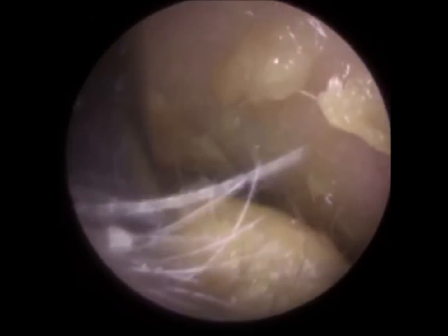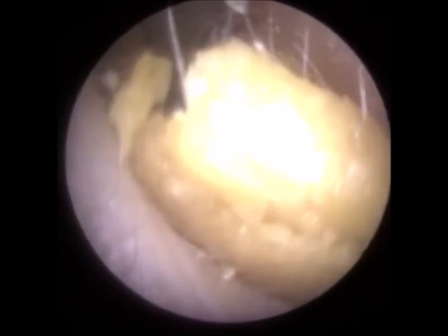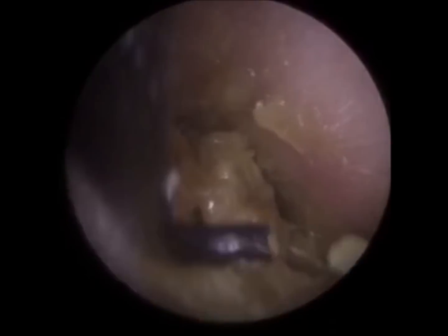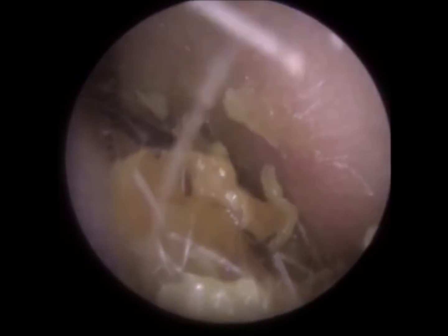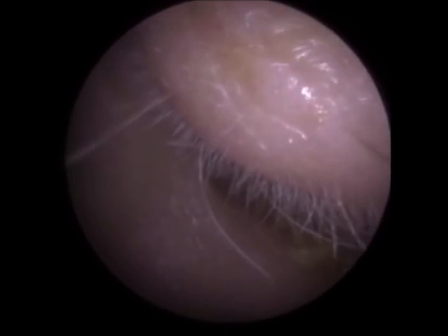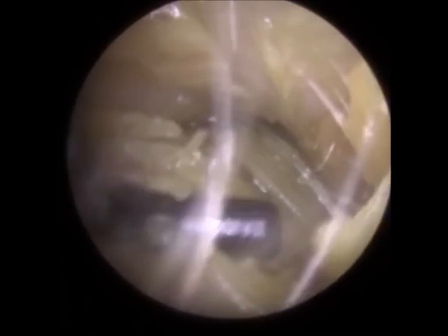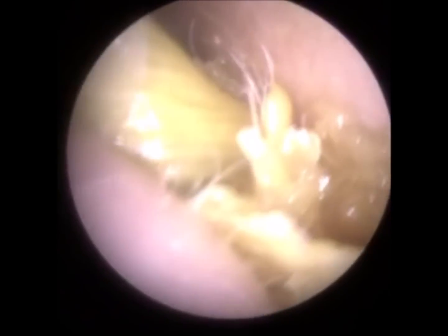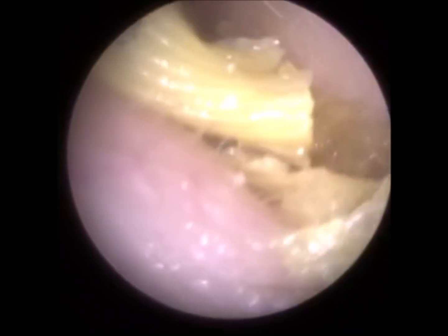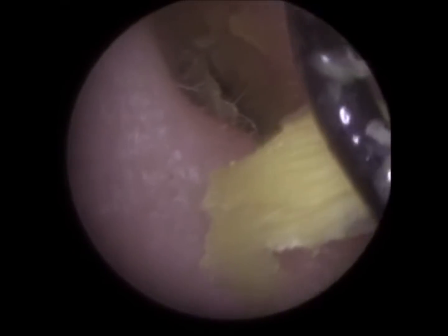So at the moment we're still using some suction there, and I'm now going with an ear hook. The idea with an ear hook here really was if I can get this plug of skin out in one go. But you'll see during the procedure, when I use an ear hook, it didn't. At some points it did remove big chunks like here, but at other stages it didn't. But when it didn't, it did help me almost dissect this keratin, this dead skin. You can see there's ribbons and ribbons of dead keratin here. The patient hasn't really had his ears examined for, I think he said, 20 years, so who knows how long this has been in there. Well, we know it's been at least 20 years.